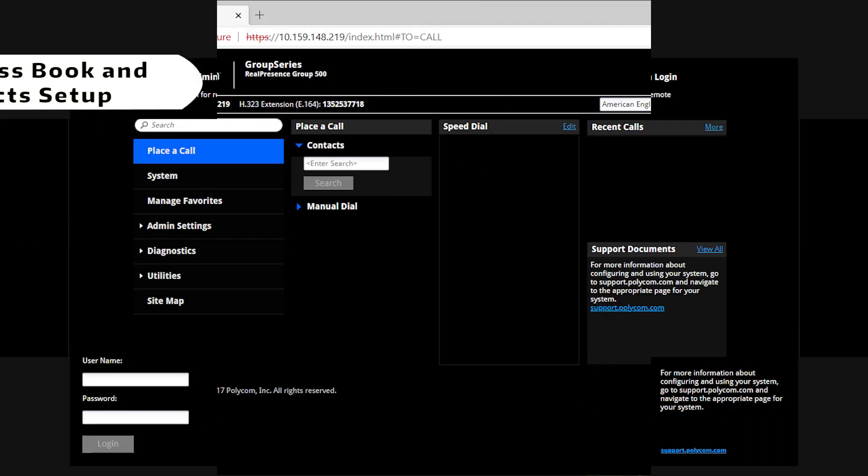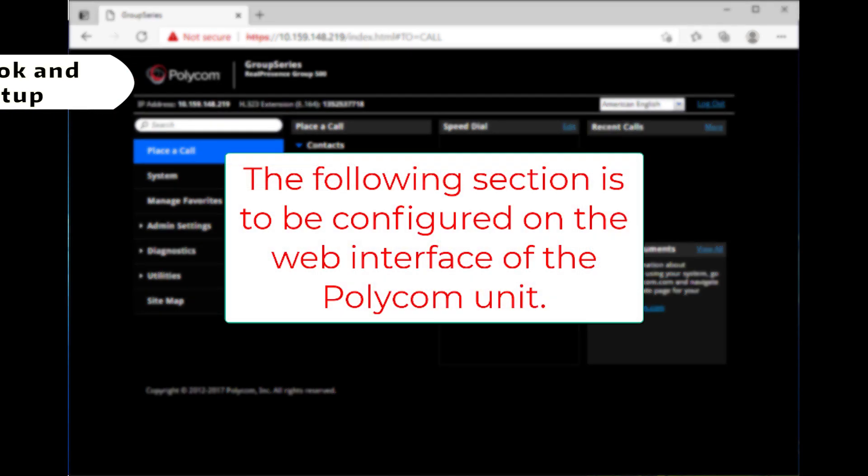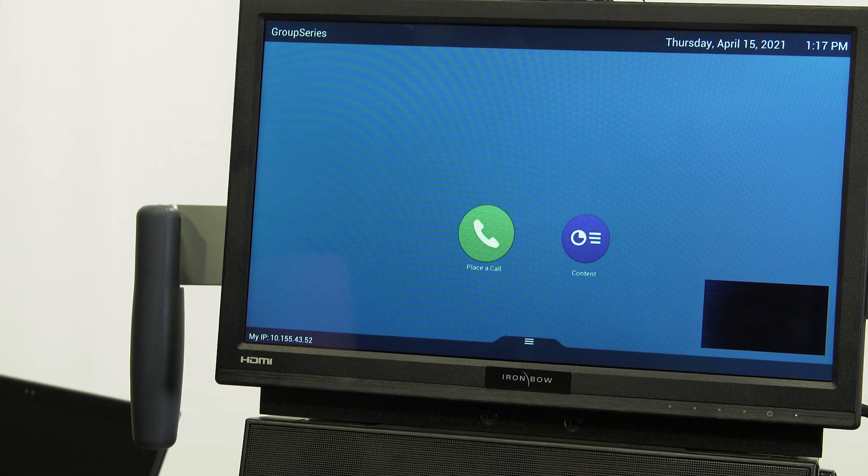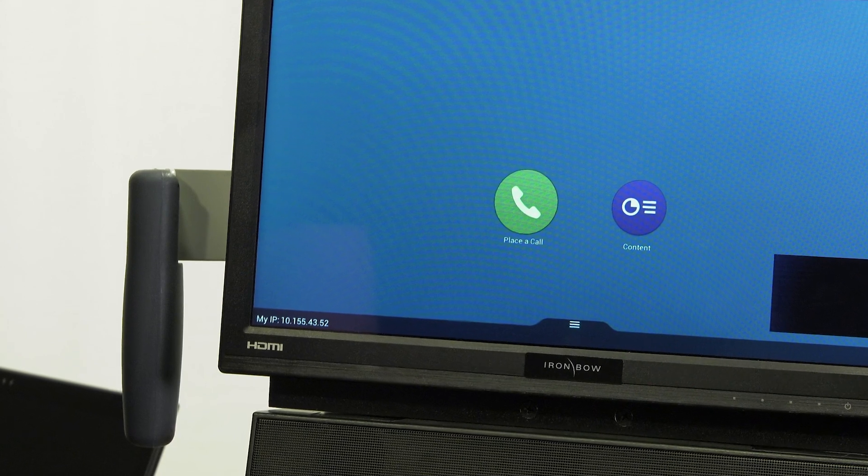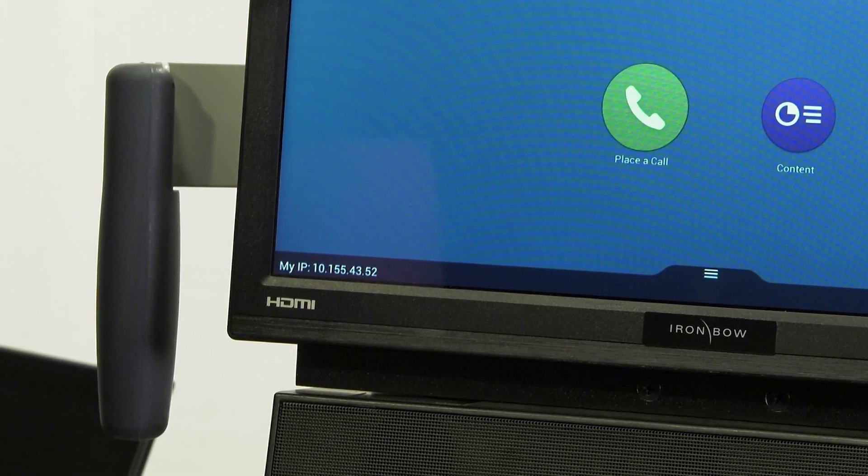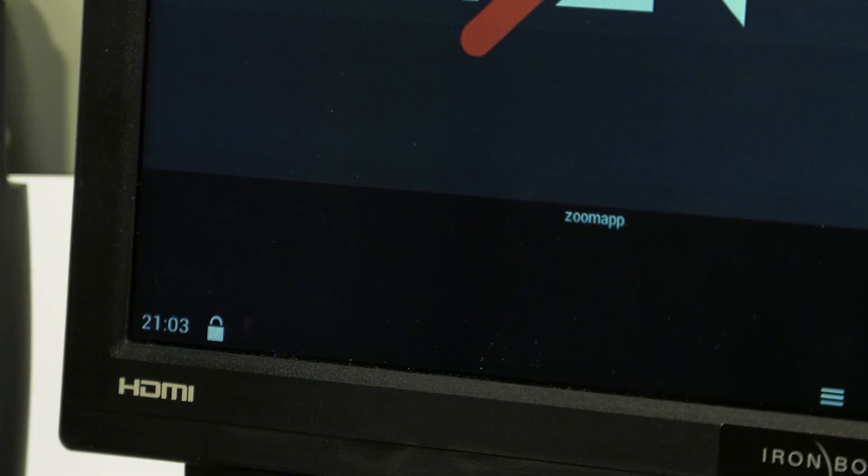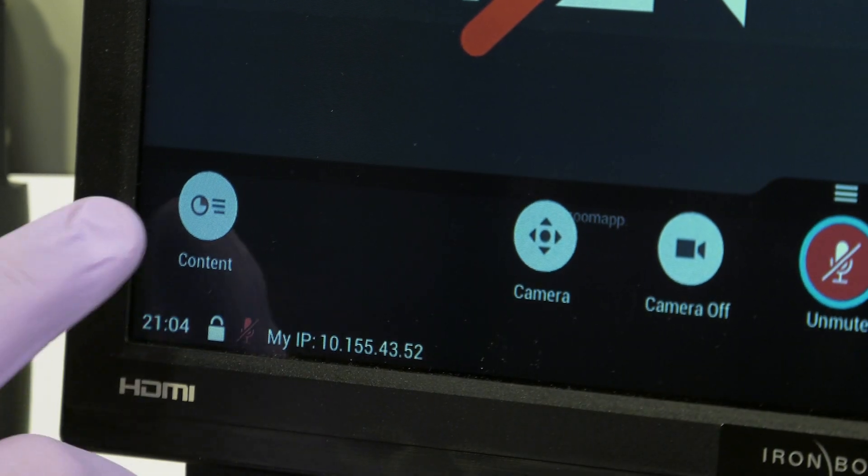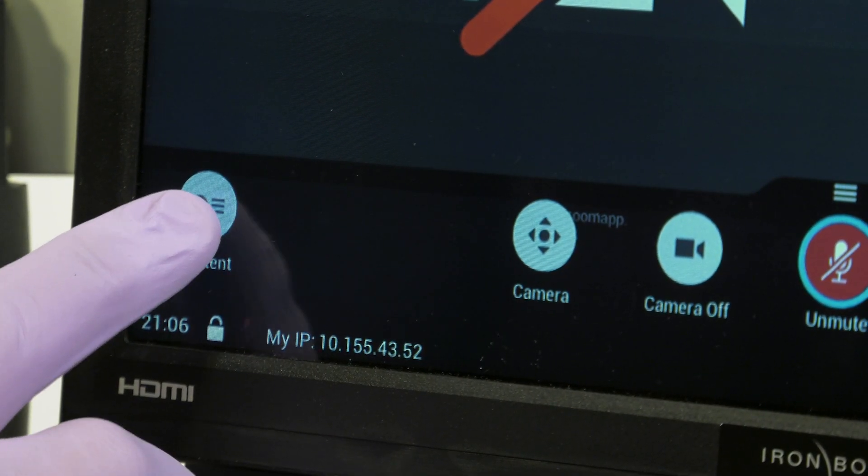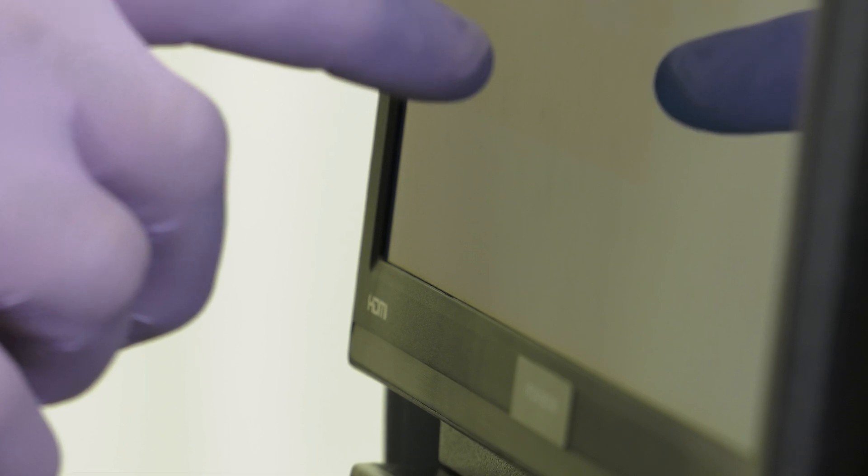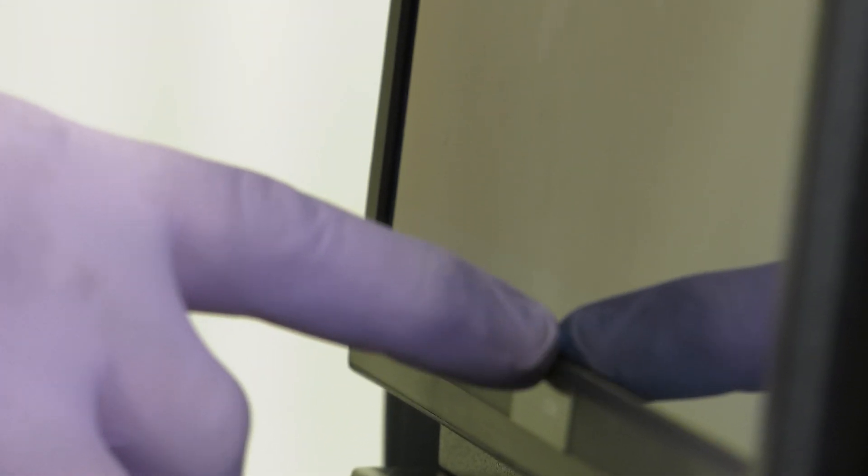The address book is useful for creating a one-tap button for calling into the Zoom room. Do note that these settings must be configured through the web interface of the Polycom unit. Review the previous steps for setting up a static IP to easily access the web interface. Otherwise, if a static IP was not set, you will use the IP address listed under My IP on the main screen of the unit when it is connected to the network. If there is no IP address displaying, skip forward to the troubleshooting section of the video.